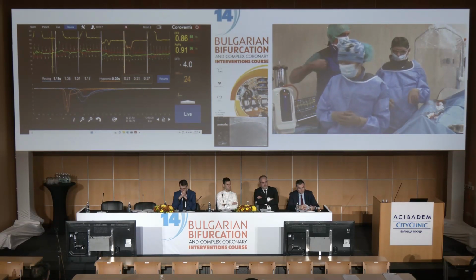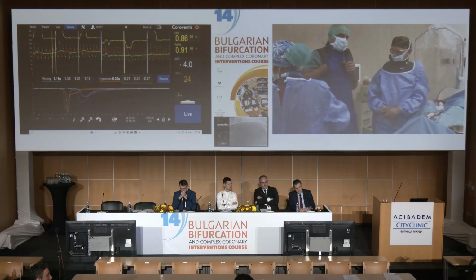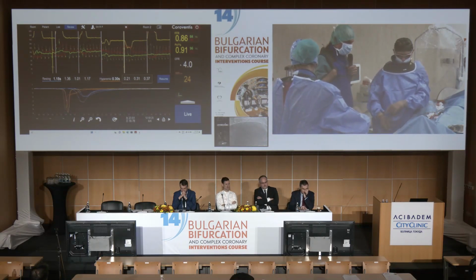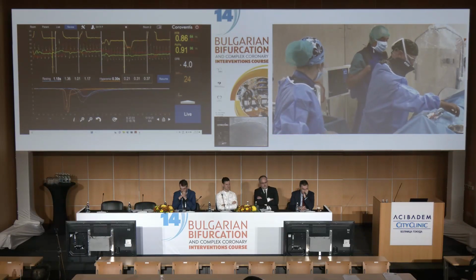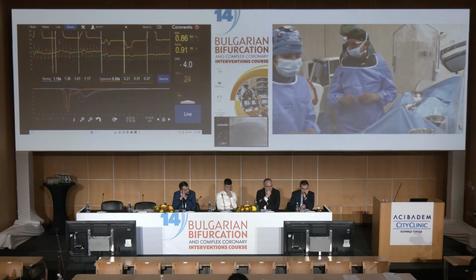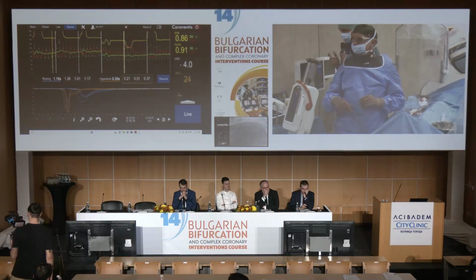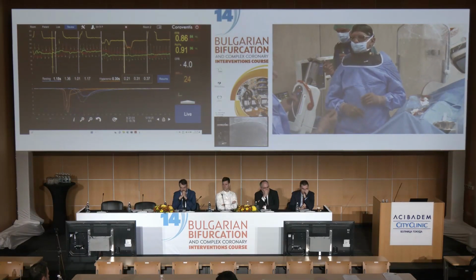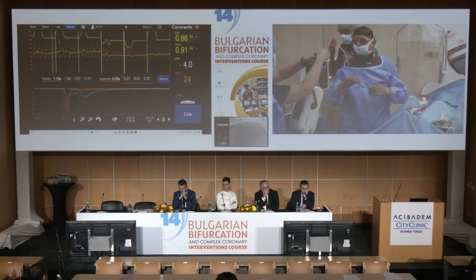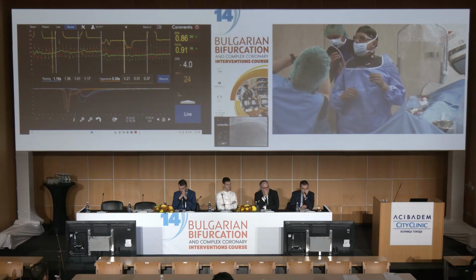So give us a couple of seconds, because now we are going to switch from, again, bolus thermodilution to continuous thermodilution, and the people here have to install the injector. Now, in a nutshell, again, the difference between bolus and continuous is that in bolus thermodilution, we take a syringe of 3 cc, 4 cc, we inject the bolus briskly through the guiding catheter. This is made by hand, and you can imagine that if you do that by hand, there is somehow an operator interference.